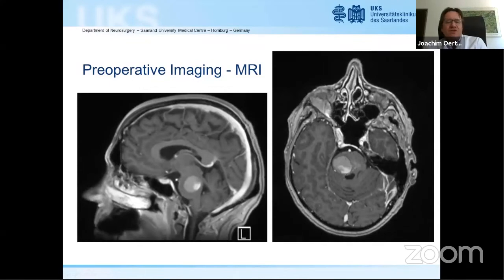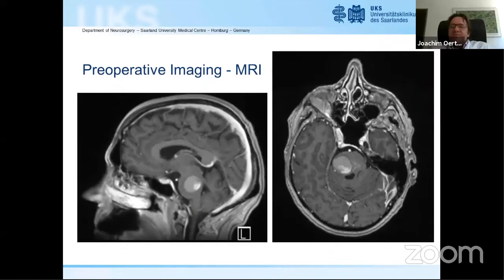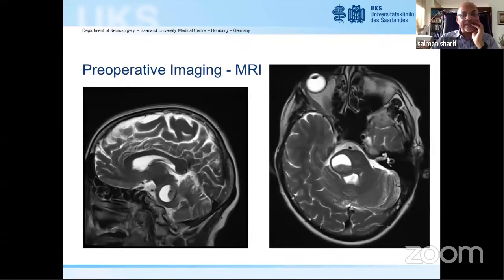Glioma with hemorrhage. Okay, I would not go for pilocytic, but maybe a malignant glioma. Maybe sometimes pilocytic can become malignant. They tend to bleed, but it's rare. Of course. Anybody else? Any other options? Anybody else giving any options?